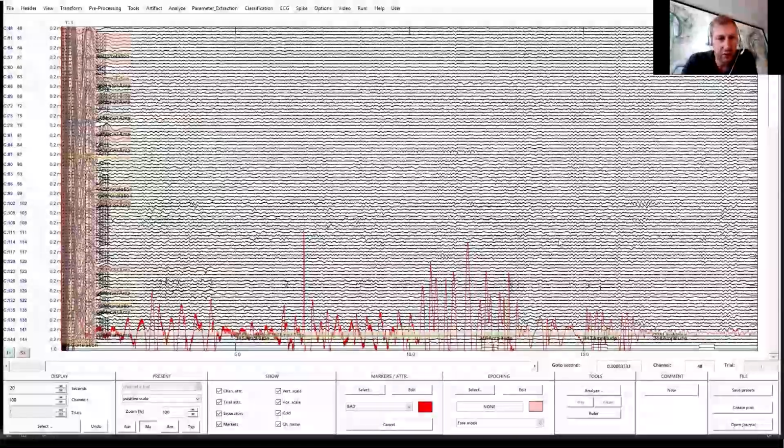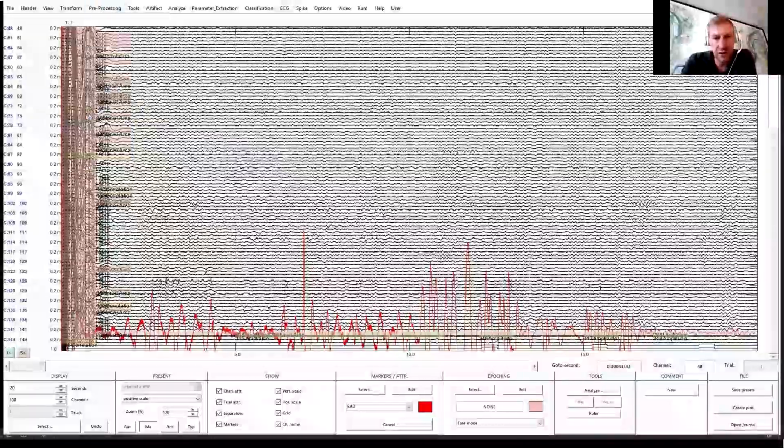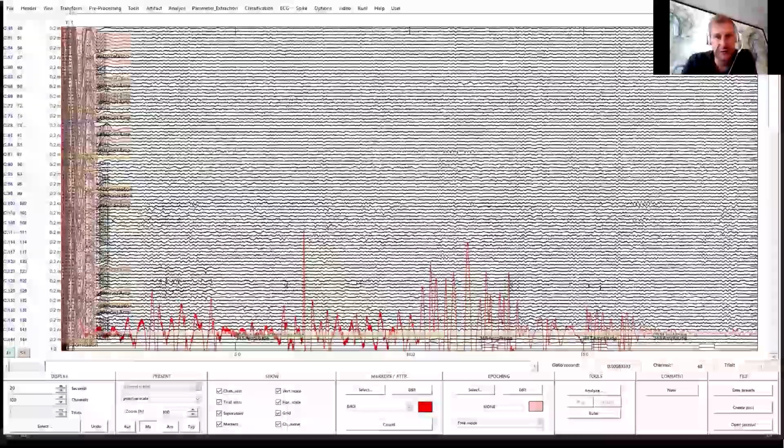So here you can see the majority of the signals look clean, and at the beginning, in the ringing settling artifact of the filter, we can see a lot of selected bad epochs. And now when we scroll through the data, we identified one channel in red that is really bad, that is just floating around with huge amplitudes. So we will not consider this channel, but the rest can be used after the filter stabilized.